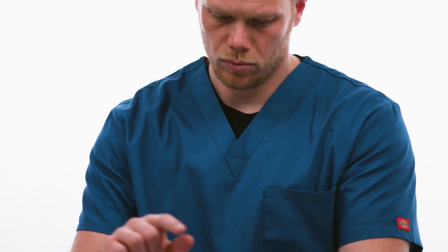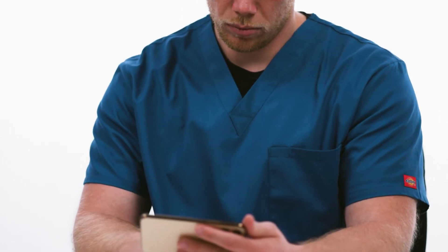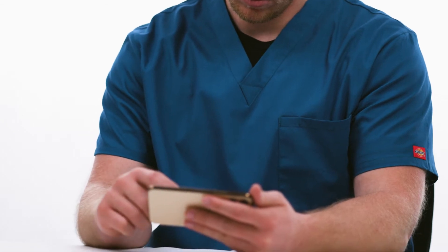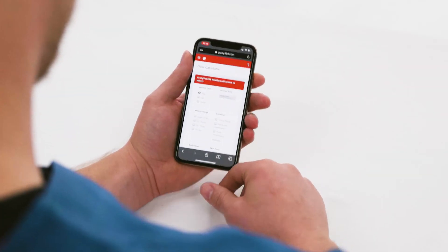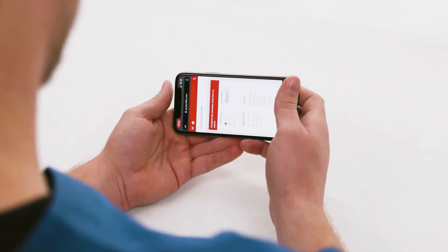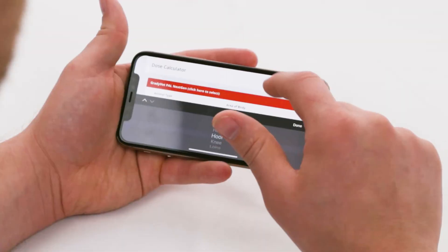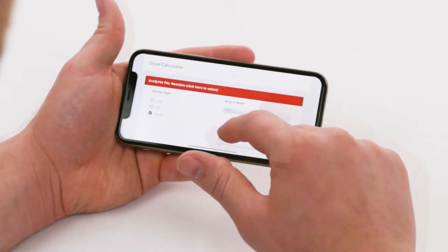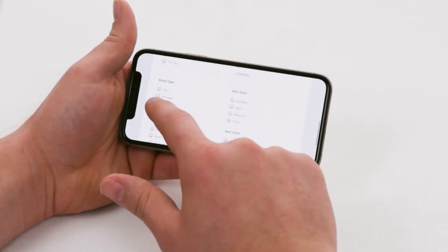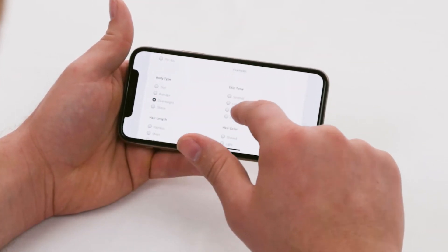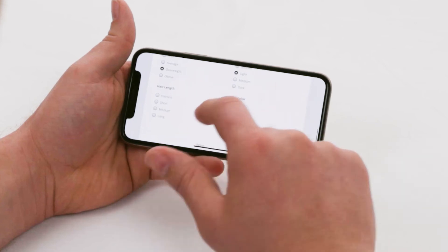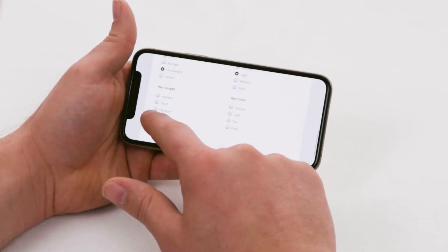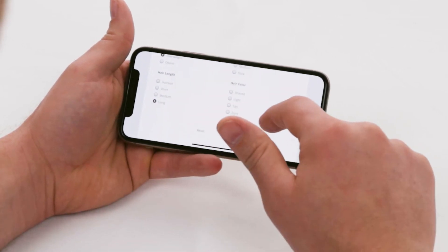After you've gotten acclimated, begin your first treatment. Under the Dose Calculator tab, enter in all the patient details including animal type, weight, body type, skin color, hair length, hair color, and lastly the condition as well as the affected area of the body.